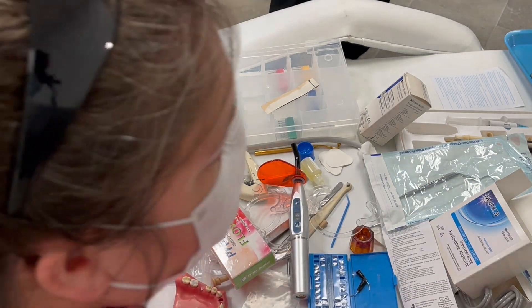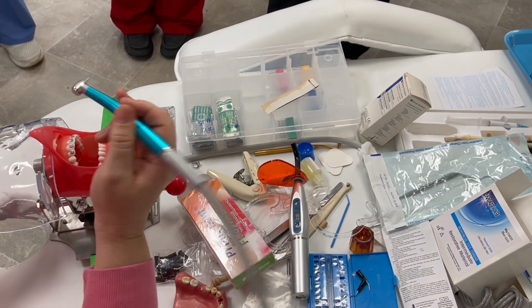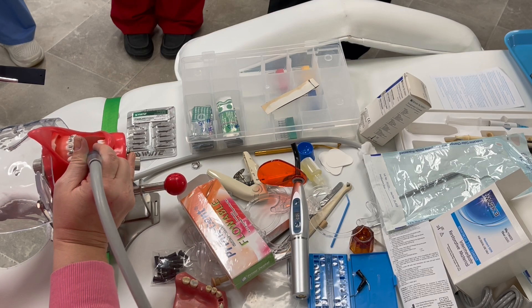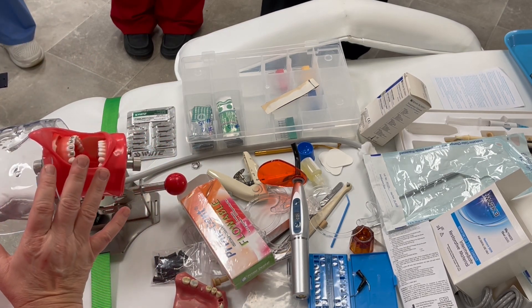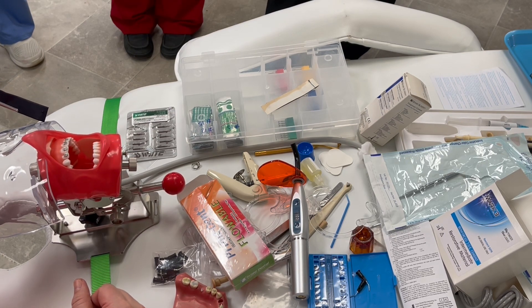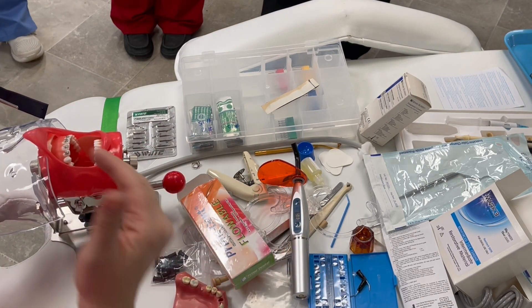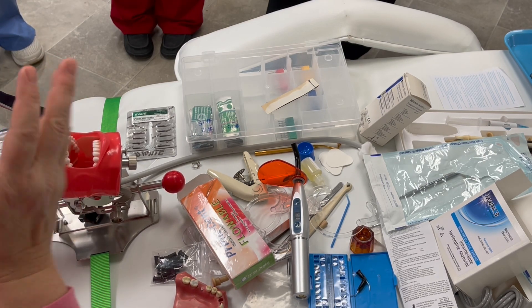So then you're gonna take your high speed and say we're gonna adjust your bite. You tap again, and if it's still just showing up on the composite, you just keep that process going back and forth. What size drill bit would you use for adjusting? It's up to the dentist — usually a finishing burr like a 7901 or 7803, just to take slight shavings off of it, slight adjustments.